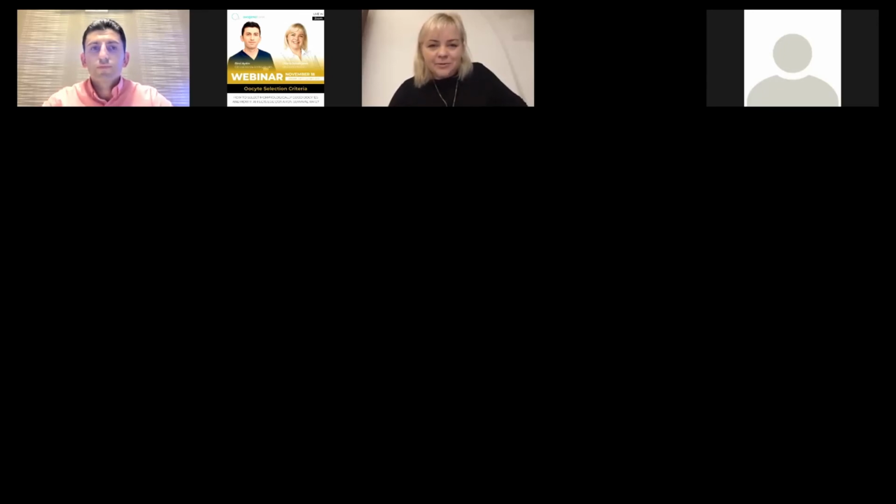Another question from Carol. Thank you for your lovely talk. Thank you. I would like to know what media is used for vitrification, Kitazato and Cryotop open system. Yeah, we are using a Kitazato protocol and open system. Also, of course, there is a possibility for the closed system, depending on regulation and on the request of the clinic. But mostly, our frozen egg bank has the open system Cryotop.